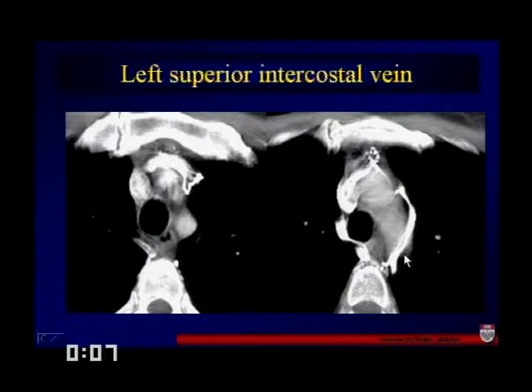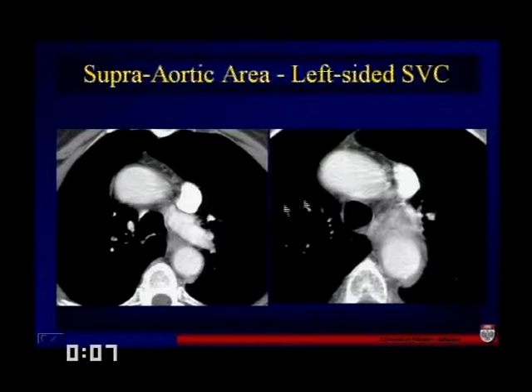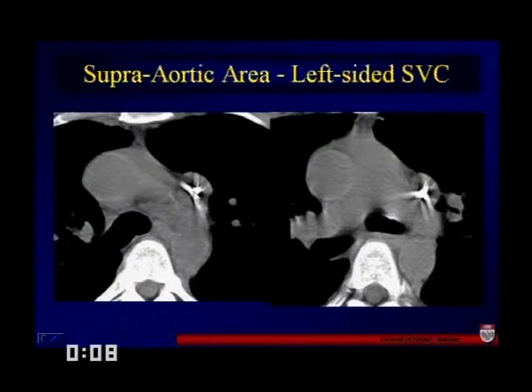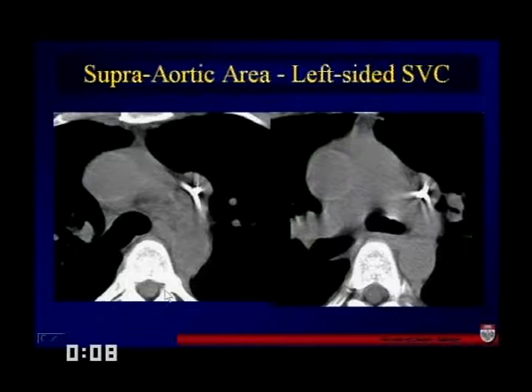This is another variant of normal — a well-opacified vessel coming down towards the AP window region — this is a left-sided SVC. Sometimes you might see a catheter in an ICU patient who's had a left subclavian catheter placed where it heads directly downward in front of the aortic arch; it's more likely that it's going to be in a left-sided SVC rather than an arterial vessel. Here's another case of a left SVC with a catheter actually cannulating it instead of crossing over into the normal right-sided SVC.